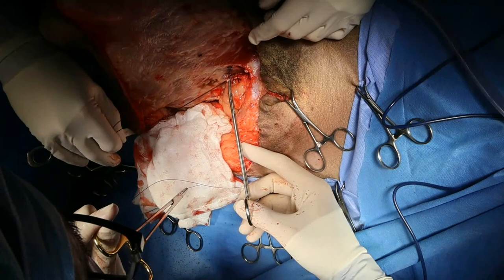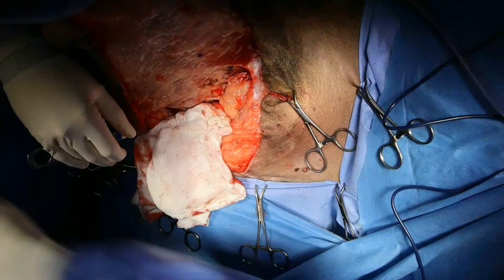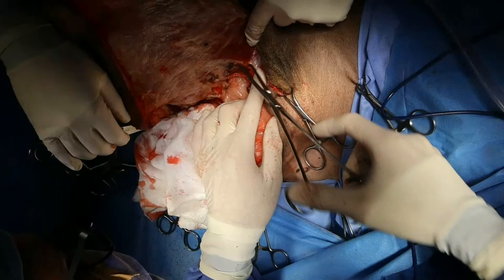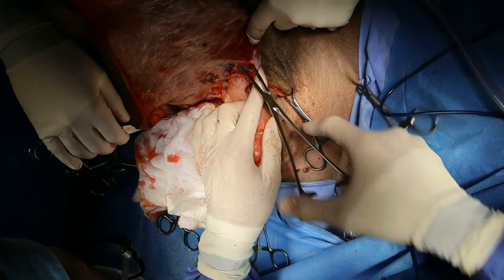This must be new Metzenbaums. They're very sharp, or recently sharpened. All right, so now I've got the femoral vein in here, which is about the size of a Sharpie. And I don't need to transfix the vein.